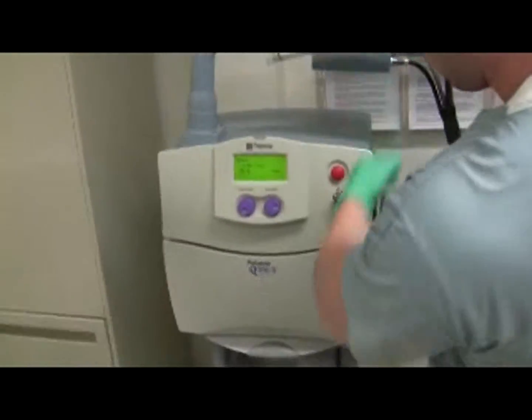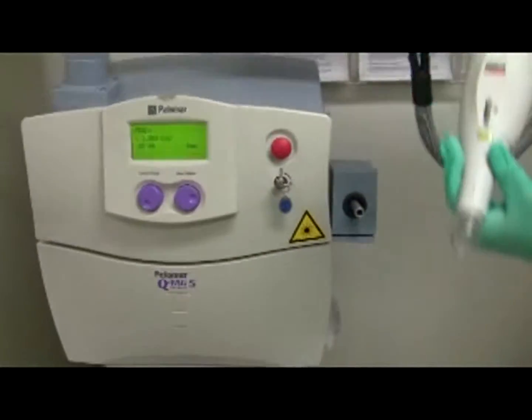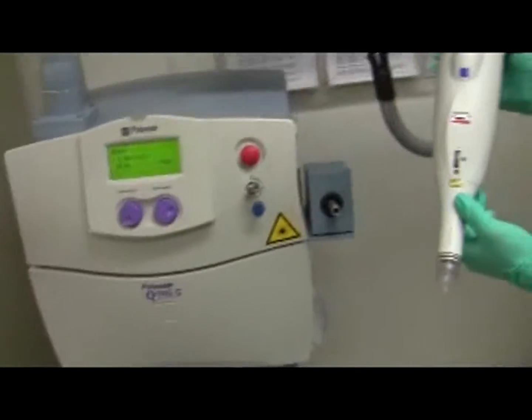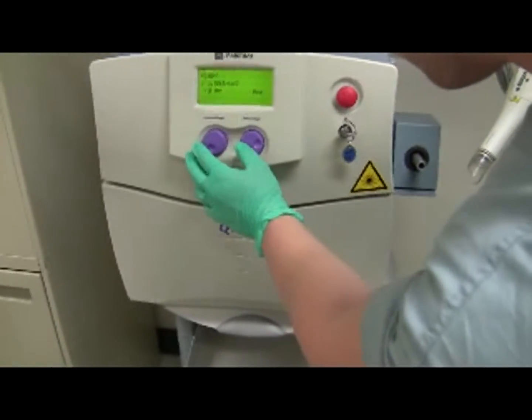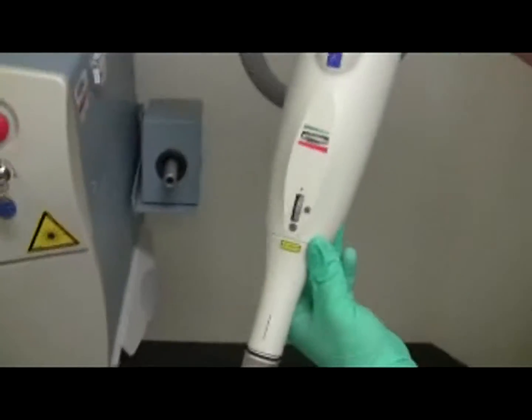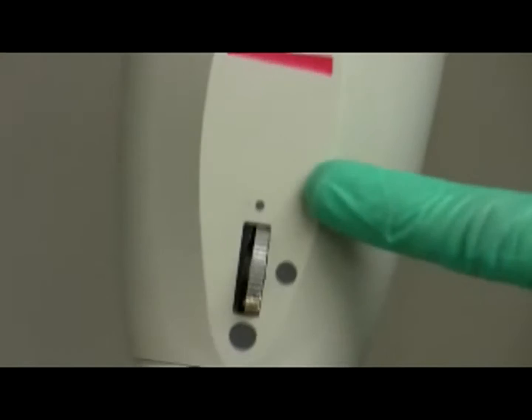Choose the desired spot size using the dial on the handpiece — don't press anything else. The size of the dot is directly proportional to the diameter. The options are two, four, and six. Let it focus for a second because it takes a moment to focus in.